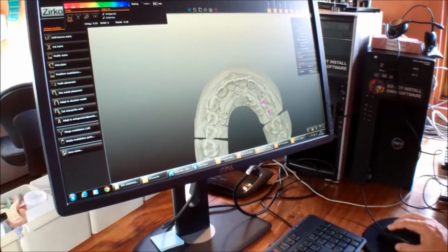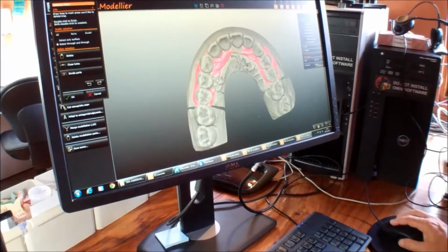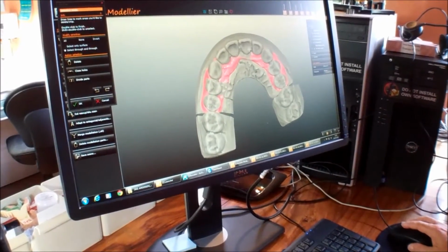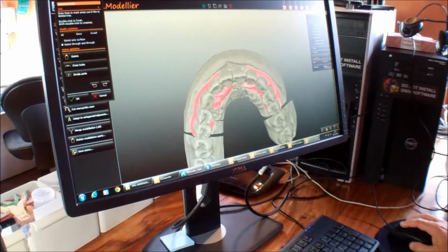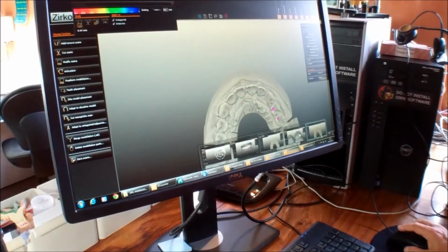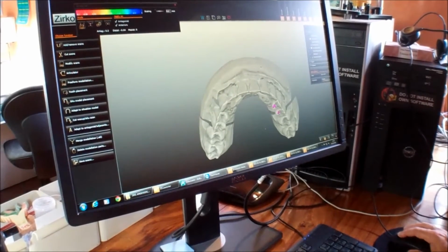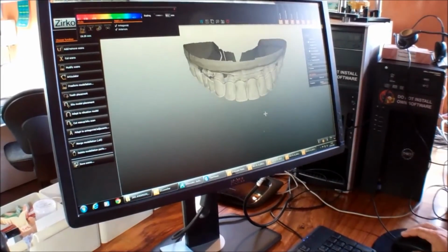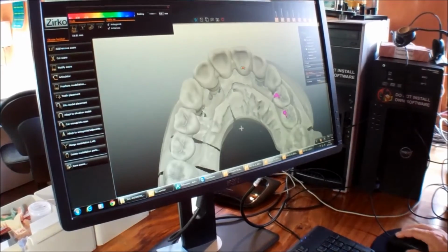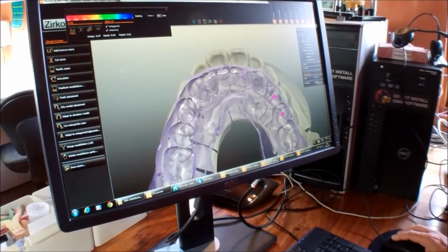This is cut. Now we cut. Before, it was like this, the entire anatomy. This is going to be the anatomy that you're going to have at the end with the porcelain. Then we cut it. Yeah, I cut it down like 1 millimeter. Ground down the material. So I have the function here. You see, so I don't have a problem.